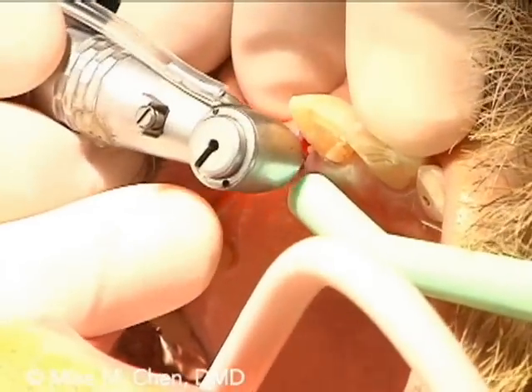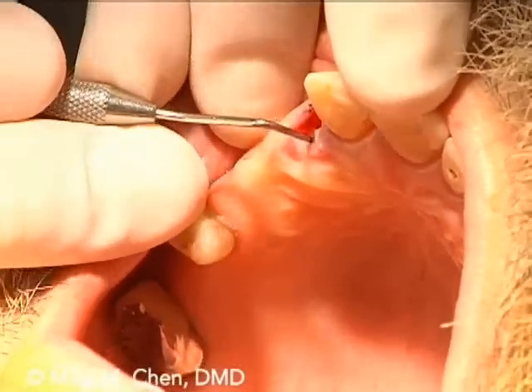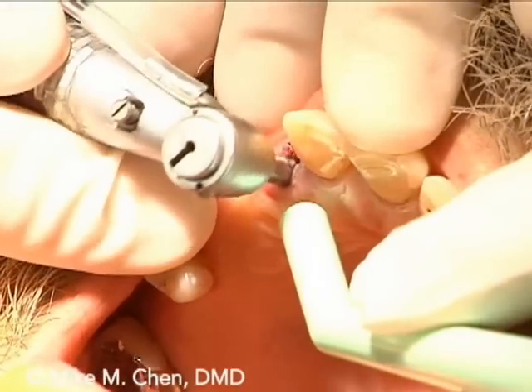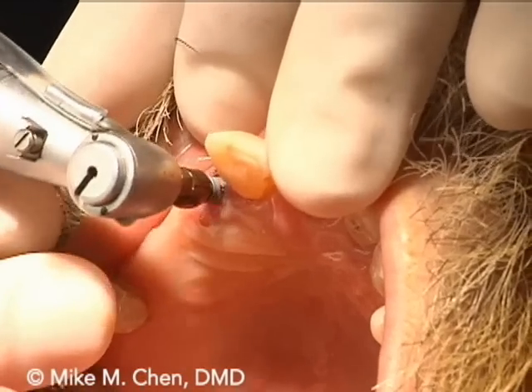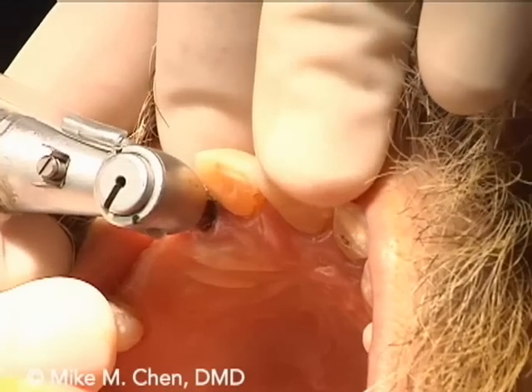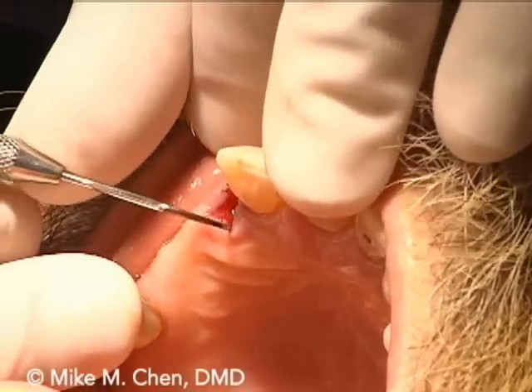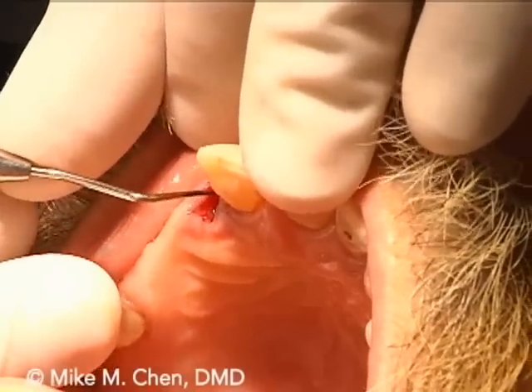In this case that you're looking at, the tooth has just been extracted, basically checking the socket and going through the drill sequence exactly the same way as if the tooth was not there at all. You go with the pilot burr and then you go with the final drill. And sometimes with the extraction site, the length tends to be a little bit longer. Usually in this situation, I tend to use maybe a 13 millimeter in length. Diameter, whatever will close up that osteotomy site or the extraction site.